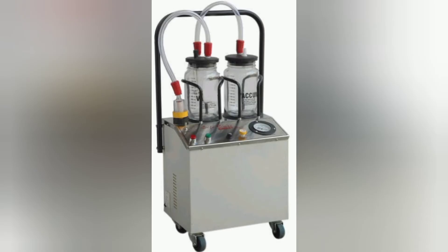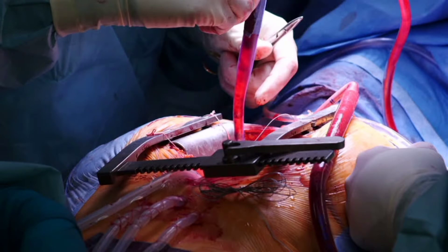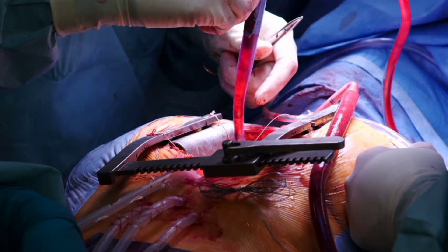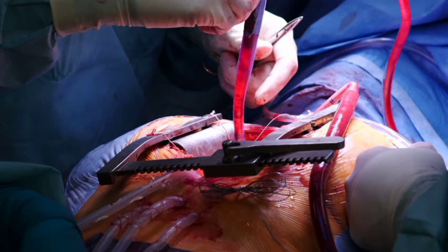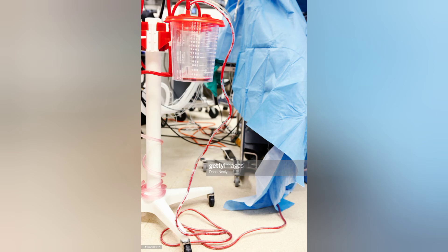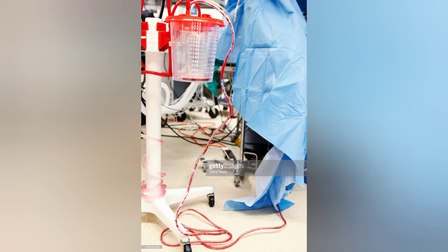The next equipment used in OT is the suction machine. During surgery, there may be loss of blood and other body fluids. To avoid accumulation of such fluids in the surgical area and to keep the surgical field clear, the suction machine is used. It simply sucks all the bleeding and secretion of fluids and keeps the surgical area clear so that the clinical team gets a better view and space to work properly. All the suctioned material is collected in large bottles and then discarded. This is one of the compulsory equipments in the OT.